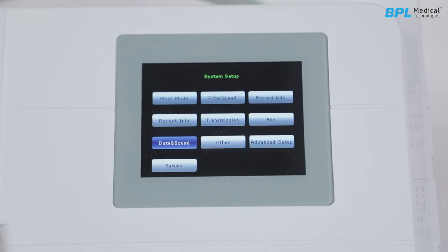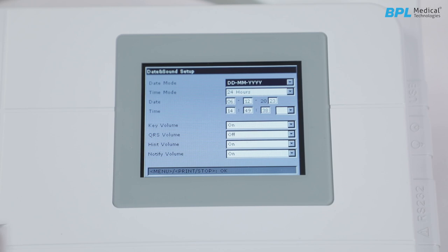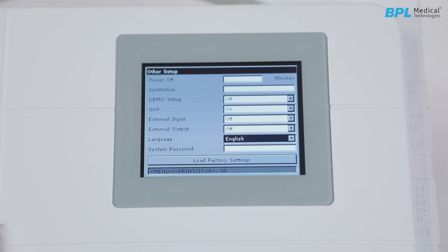Next is the date and sound setup. Date and time can be set according to 24-hour or 12-hour format. Key volume, hint, QRS volume and notify volume can be set according to user convenience. Other setup includes institution name — enter the hospital or institution name. Demo setup can be enabled or disabled, along with options for external input/output.